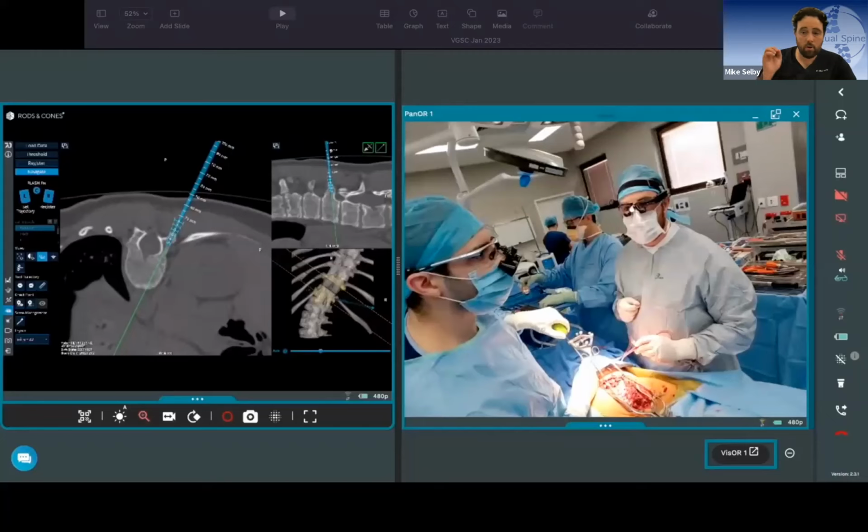As I said, I use the burr, and then I still like to put the screw in freehand because I just like that tactile feedback. But not using the awl to get down those tight spaces has really changed it for me. I've put in probably 65 pedicle screws this week myself, and my wrist isn't sore. Previously I'd be icing it and taking anti-inflammatories and having days off to try to deal with it if I had a week like that. So it has changed a lot for me in terms of this kind of work.